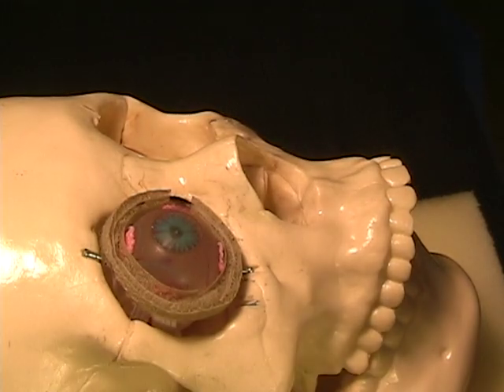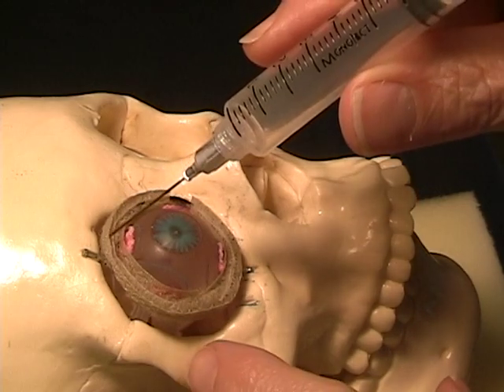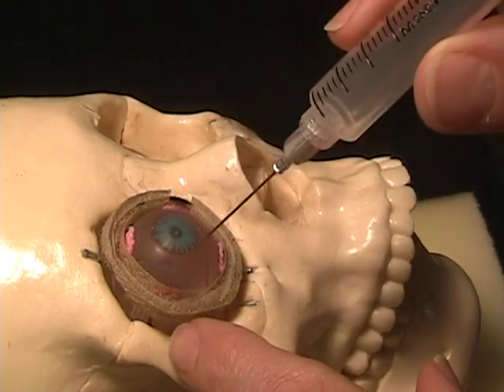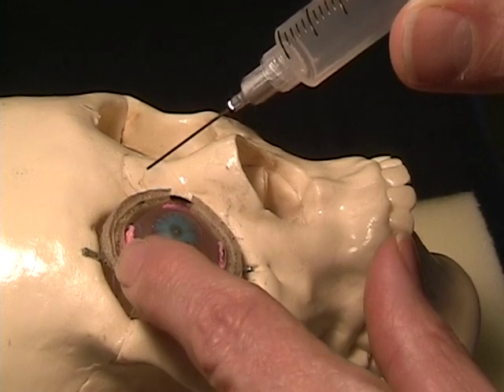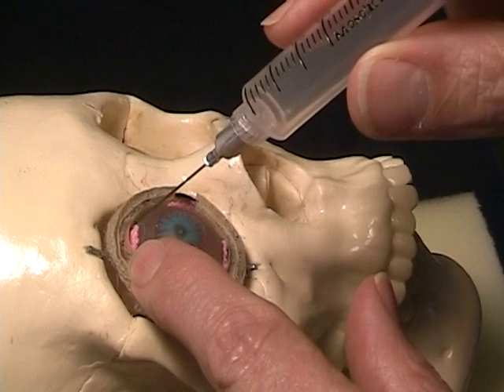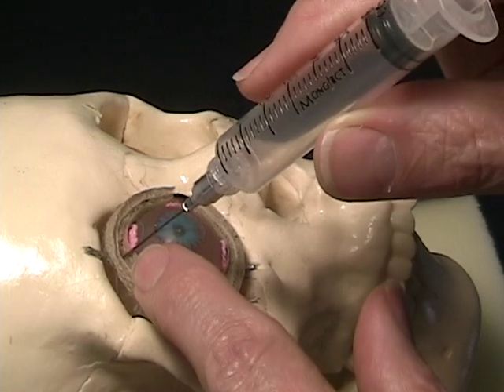We'll now see the superior temporal extraconal injection. We'll identify the landmark at 12 o'clock and slightly lateral to that, in line with the lateral limbic line. This technique is performed with the eyelid closed and the bevel towards the globe. We'll depress the eyeball downward and then, at about a 45-degree angle, insert the needle above our fingertips towards the superorbital rim.